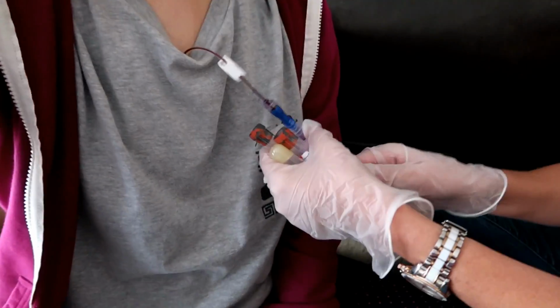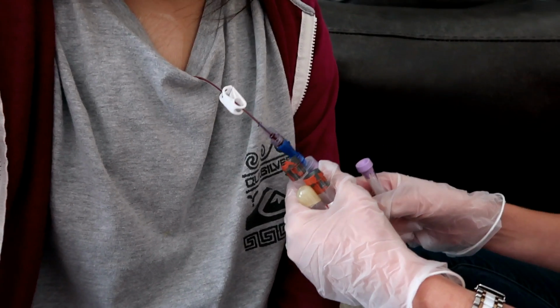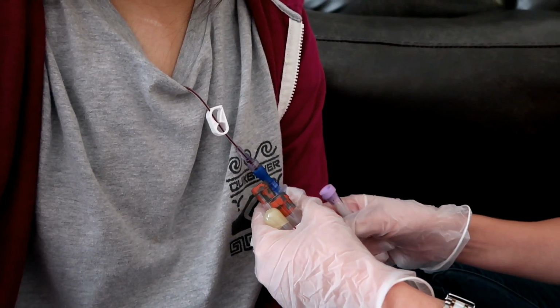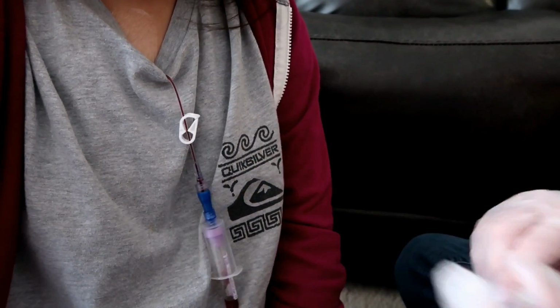No, it's really good because we've really had issues with my port being finicky, and there's a few reasons for that. What about dehydration? Were you a little dehydrated in the past when that was happening? No, because I run fluids, so that shouldn't be. And I ran fluids last night because of the IVIG. Blood. Yeah, I never thought I'd be so happy for blood until I got a central line.